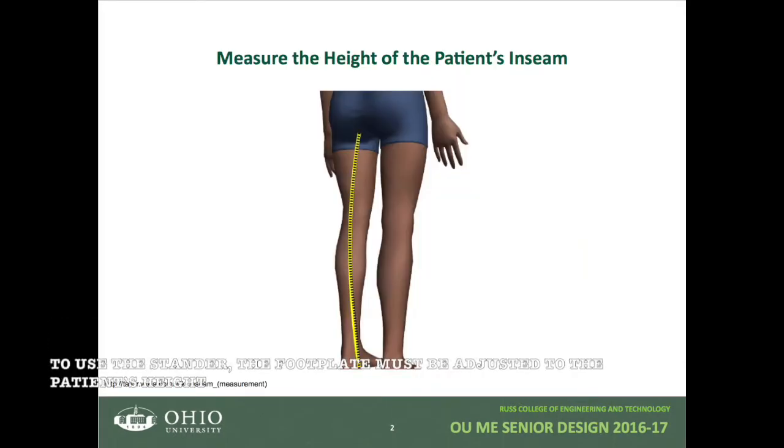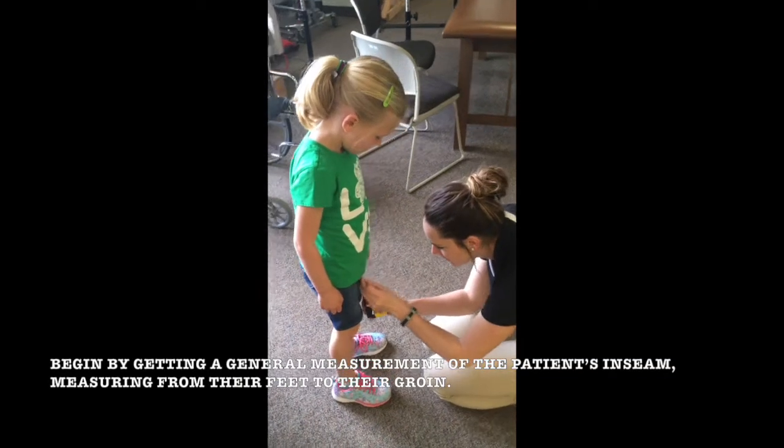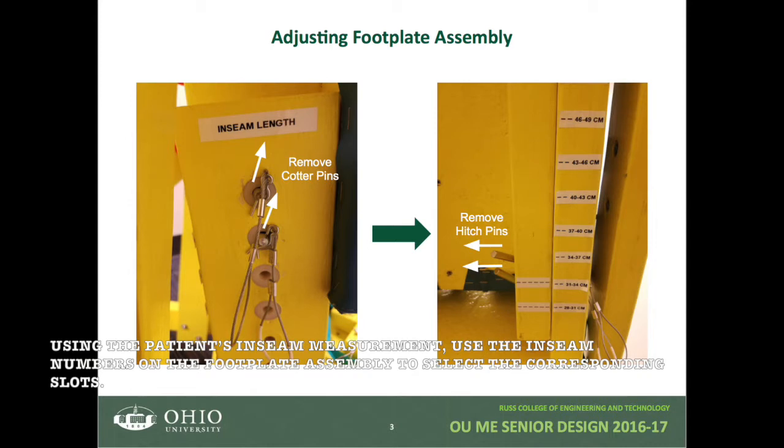To begin using the stander, the footplate must be adjusted to the patient's height. Begin by getting a general measurement of the patient's inseam, measuring from their feet to their groin. Using the patient's inseam measurement, use the inseam numbers on the footplate assembly to select the corresponding slots.